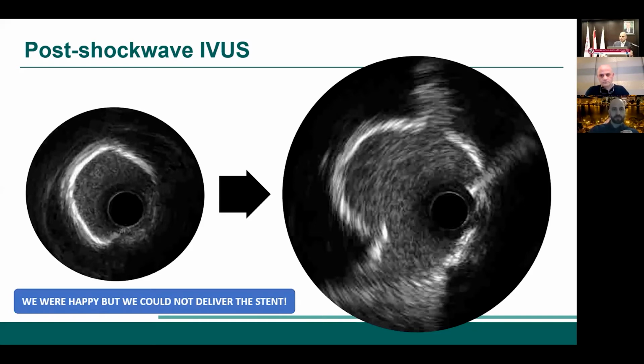So in general, we've been using IVUS here, and we'll take your comments, and I want to mention something. But the biggest challenges usually have been when you think you're good and you see your balloon is a protruding nodule or a protruding chunk that is in the lumen. And we've all faced these cases where it doesn't look that bad angiographically, but still you can't deliver stuff.